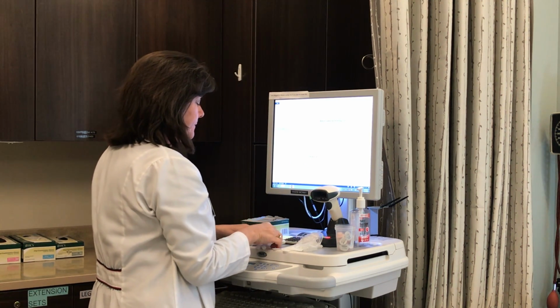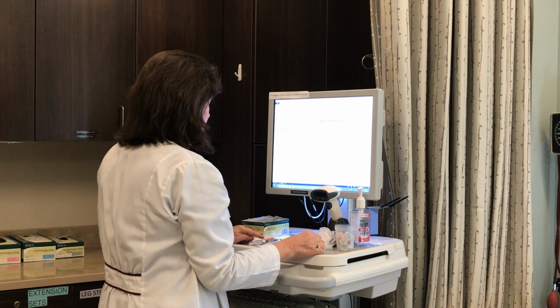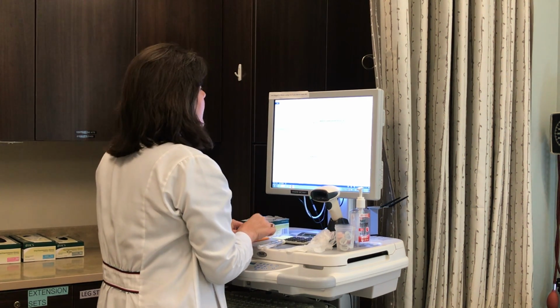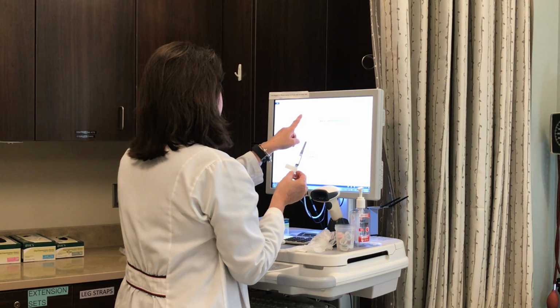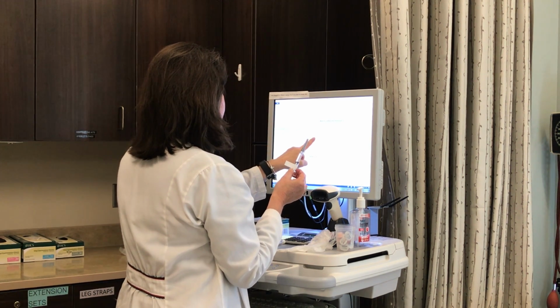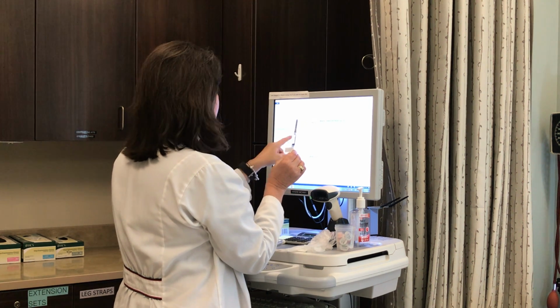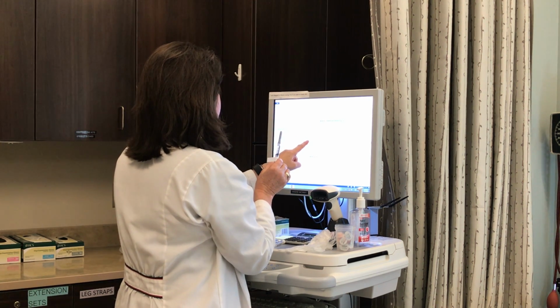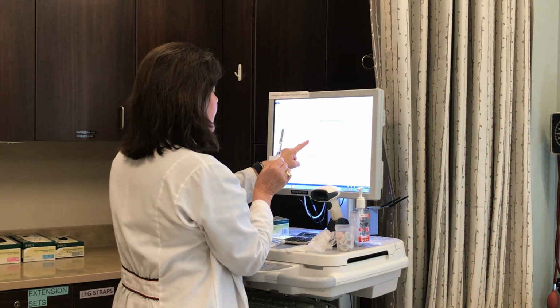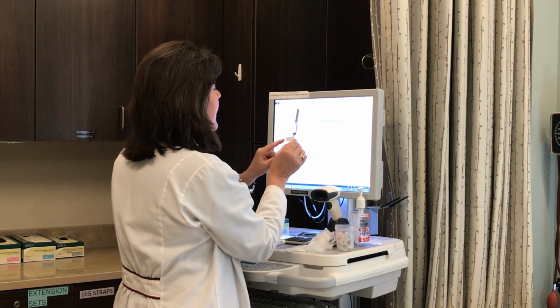Verbally verify the 5 rights of medication administration on the IV push med and the normal saline flushes. Third check of my 5 rights. This is for Diane Curtin. The drug ordered is Solumedrol. On my label, I have written Solumedrol. The amount is 200 milligrams, which I have calculated to be 1.6 mLs.